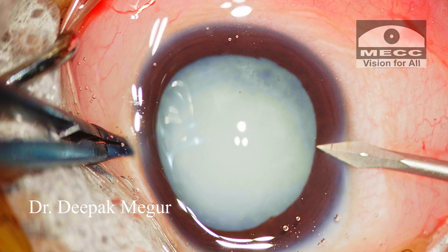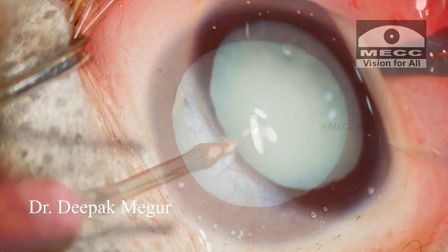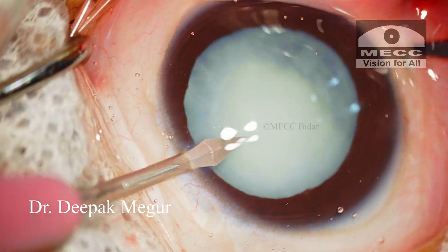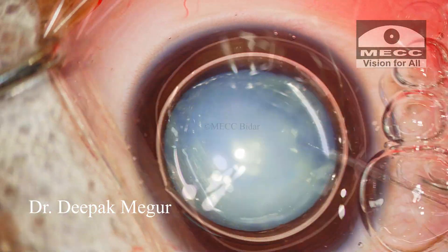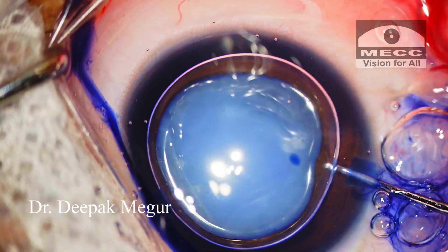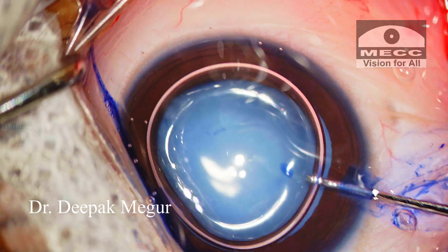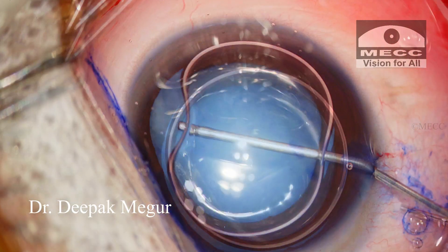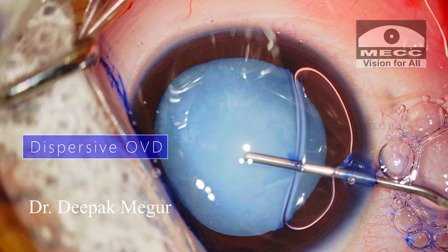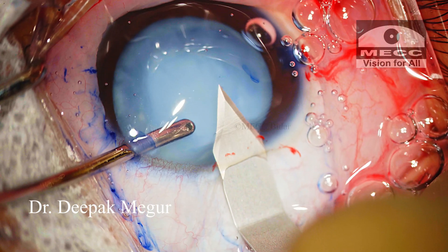The surgery is being done under IV sedation and posterior subtenons anesthesia. There are a few critical factors intraoperatively while operating on congenital cataracts. Getting the anterior and the posterior rhexis right is probably the most important thing, and then placing the lens into the bag. I prefer to use dispersive OVD for most of my cases for rhexis, including pediatric cataracts.